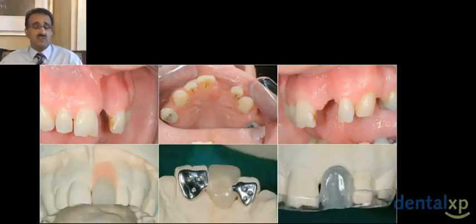But you have to design your denture to make sure that it doesn't put any pressure on the soft tissue and is well supported by the adjacent teeth. You can have a surgical template made, and the important key aspect of that template is to define where your final gingival margin is going to be, because that's the reference point to determine the positioning of your implant. So then we come to the case.